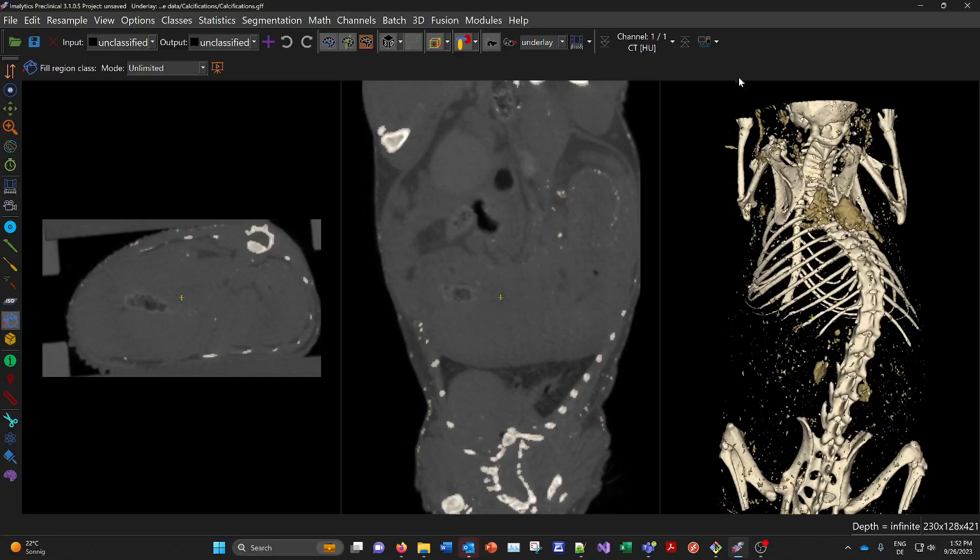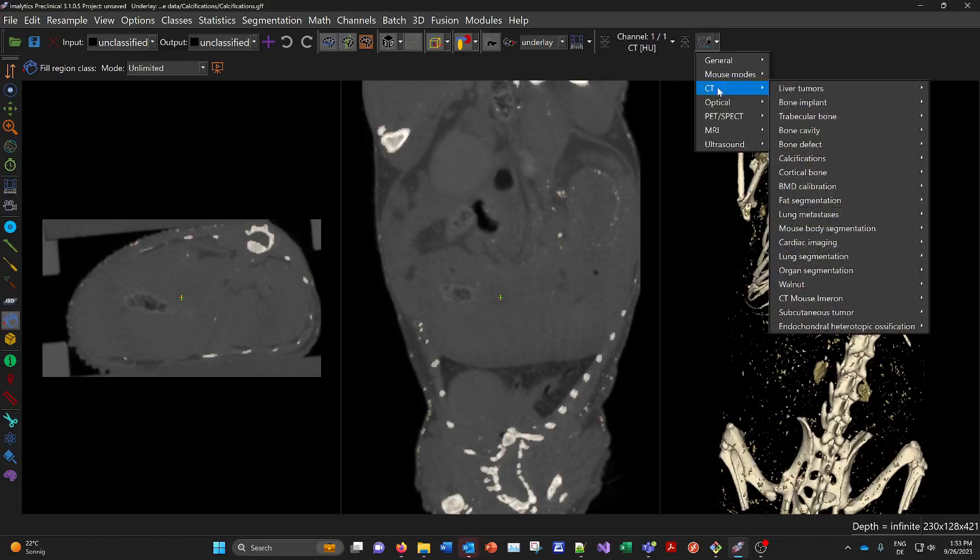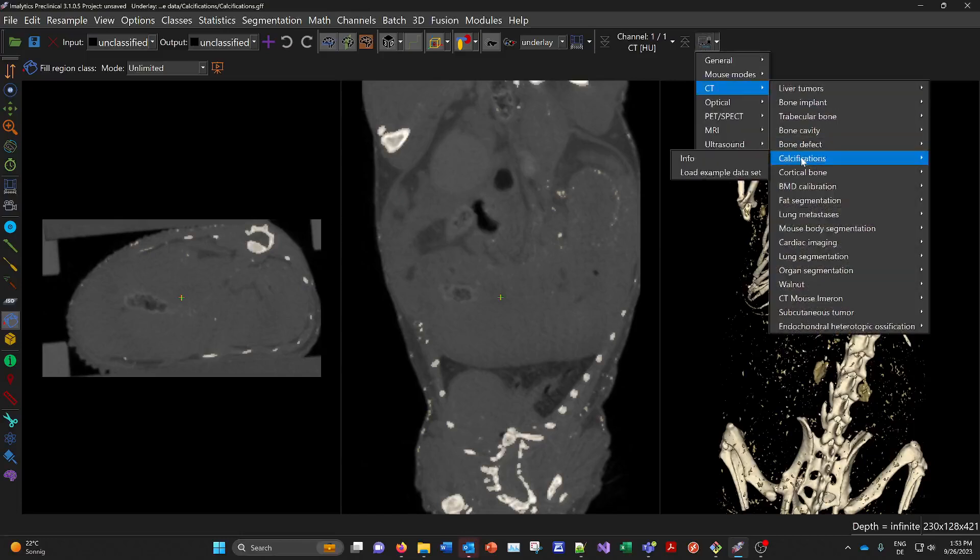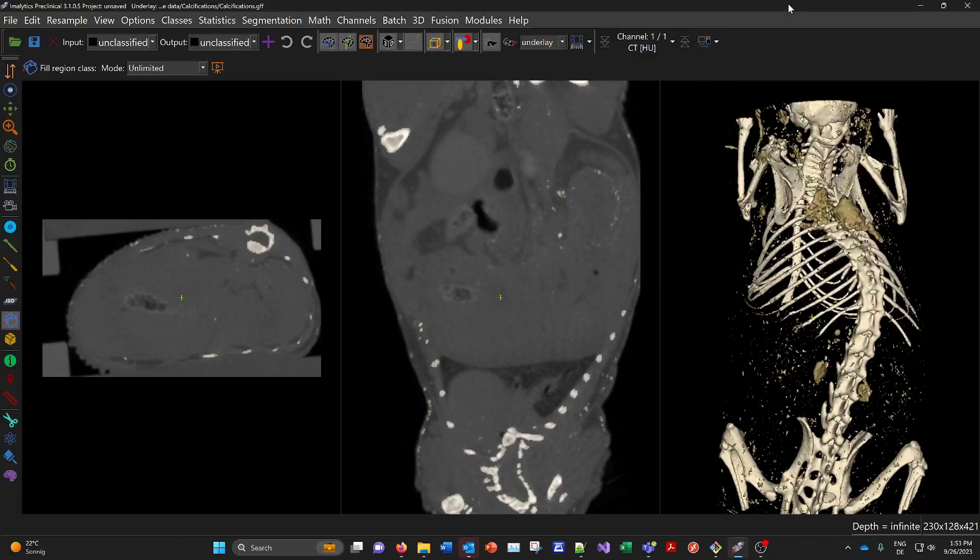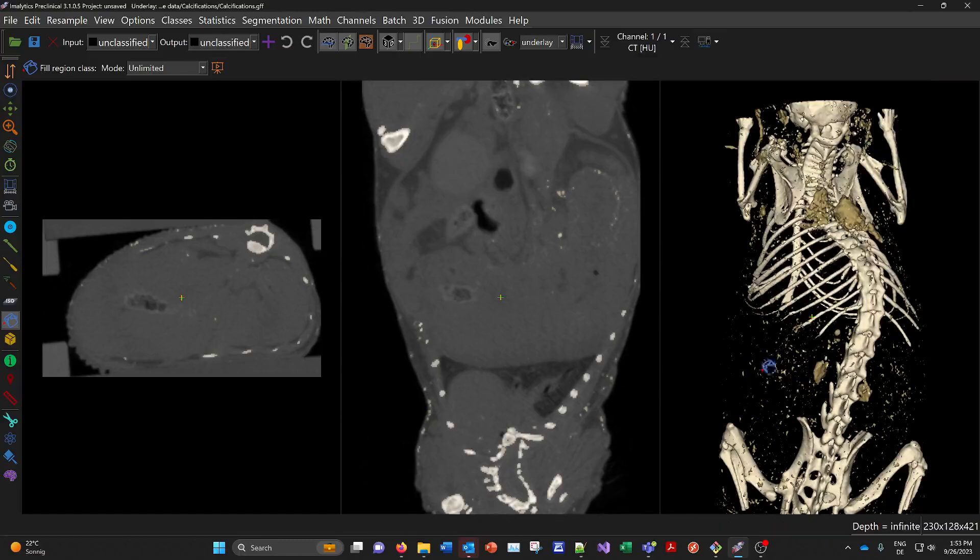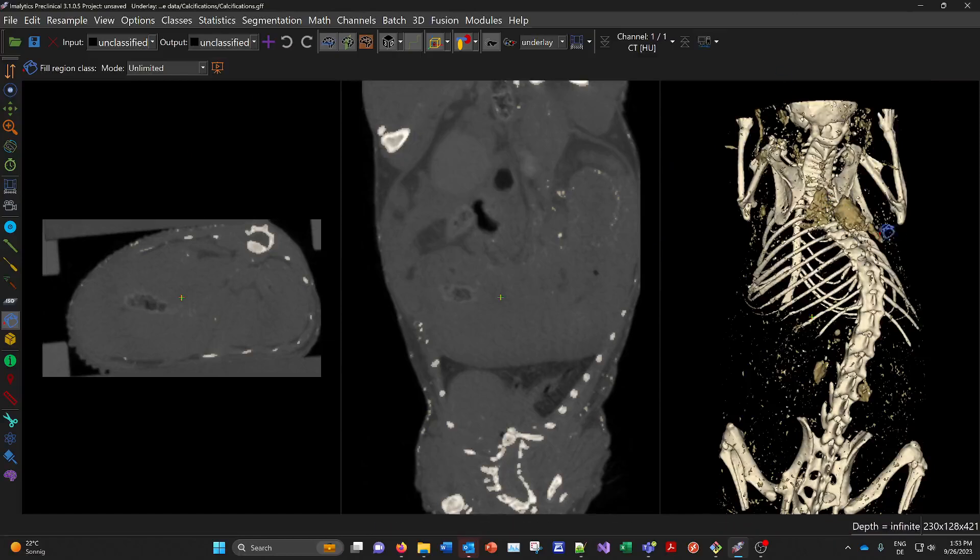You can load this example data set using the tutorial button under CT. And then with our software, the Imalytics Preclinical, you can perform a segmentation like this one and get the number of calcifications and their volumes as a quantification.